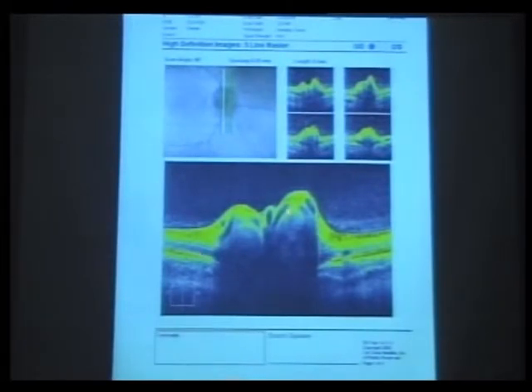What you see is you see the drusen that are buried. However, I haven't found that this is much more useful in telling the difference in early papilledema. If this was, as Dr. Chavez said, a patient who had drusen and a little bit of retinal nerve fiber layer edema, I don't think the machines are good enough at this juncture to tell the difference. So I've been using this or ultrasound just to see if there are buried drusen.